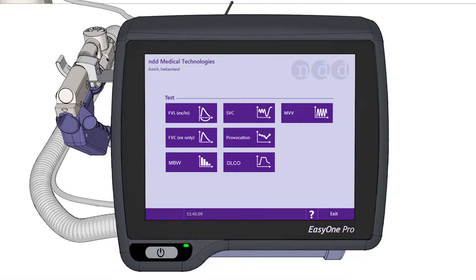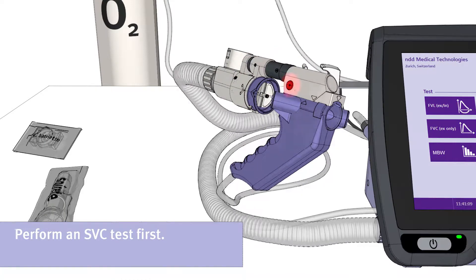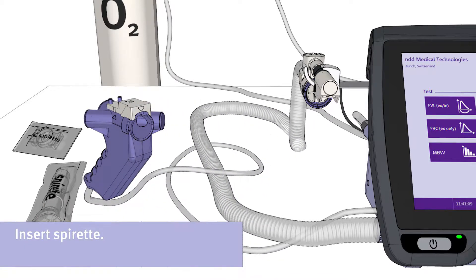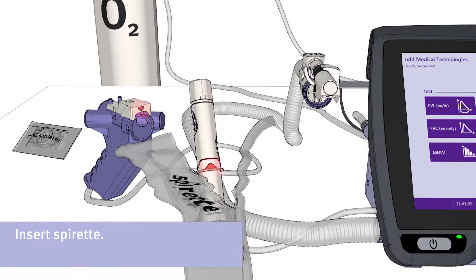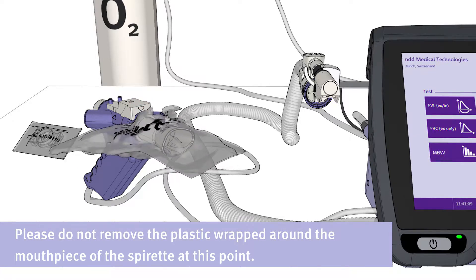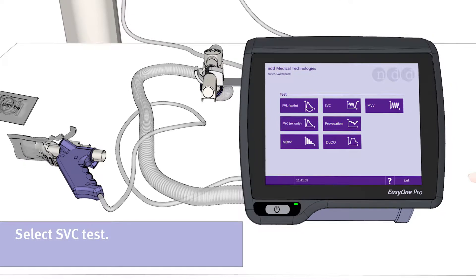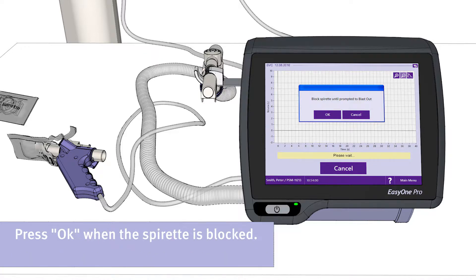To start the examination of the patient, perform an SVC test first. Please disconnect the handheld sensor in order to perform the SVC test. Now please insert the spirette. Please do not remove the plastic wrapped around the mouthpiece of the spirette at this point. Select the SVC test by pressing the corresponding button. Leave the plastic wrapped around the mouthpiece to avoid flow during initialization. Press the button OK when the spirette is blocked.